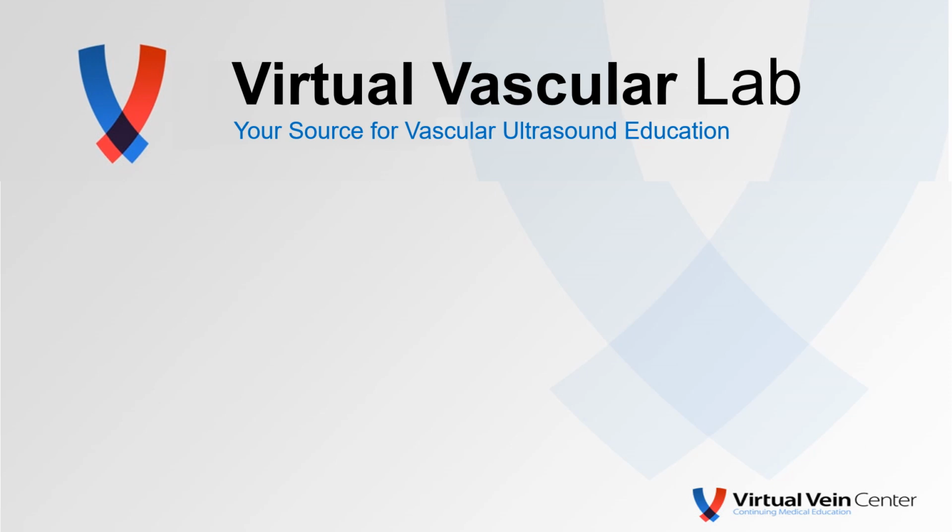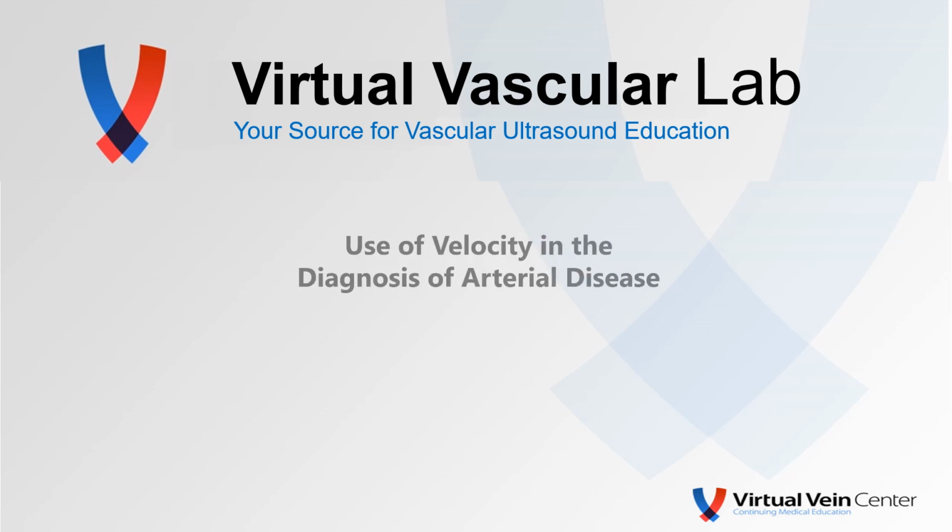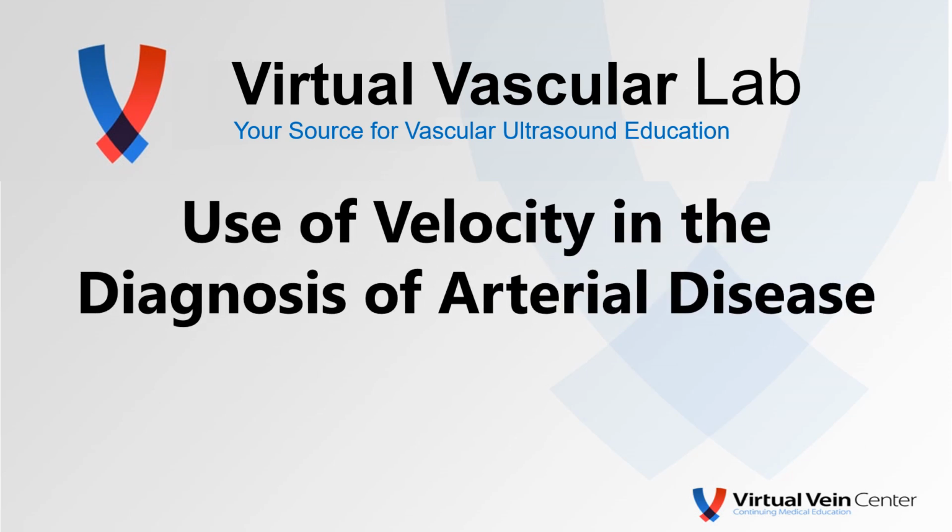Technical Tip Tuesday. Well, all the teaching that we do for vascular ultrasound, we find probably the number one source of error is improper Doppler angle correction, leading to an incorrect velocity. Probably the second most frequent error we see is the use of velocity to define disease. And this is really an incorrect application of the technology. That's what I'm going to talk to you about today. Hope you enjoy.